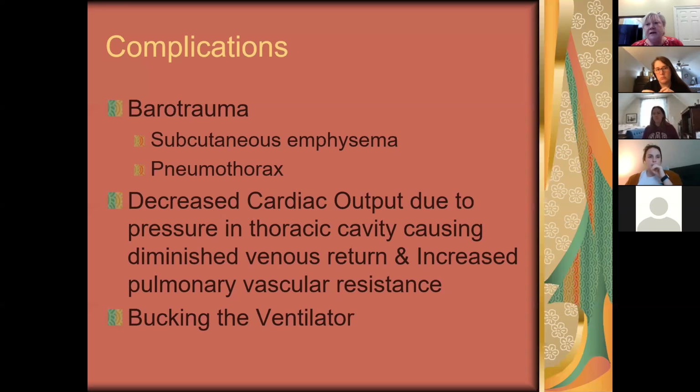Correct. Now, understand that at bigger tertiary care centers like CMC, for example, I can't speak for Pineville or University or the smaller hospitals, but at a lot of tertiary care centers, respiratory sets the ventilator settings. The doctors write an order like, I'm kind of making this part up, ICU care 1.